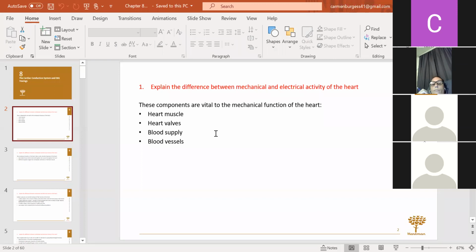So when we do that EKG, everything we've talked about till now, the leads, the electricity that goes through them, that's picking up that heartbeat and everything that's happening, because it all is sending out electrical signals. But mechanically, this is what you need and what has to happen. So we all just need to make sure that you will see this again.